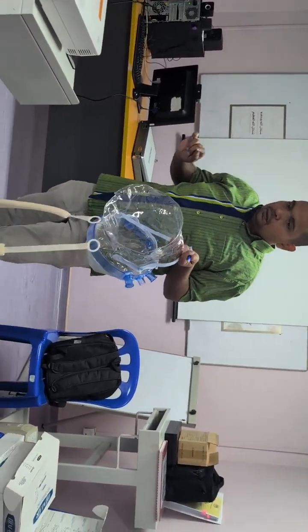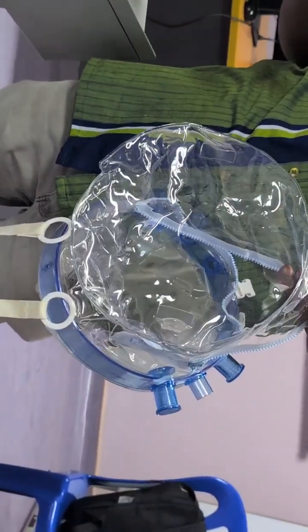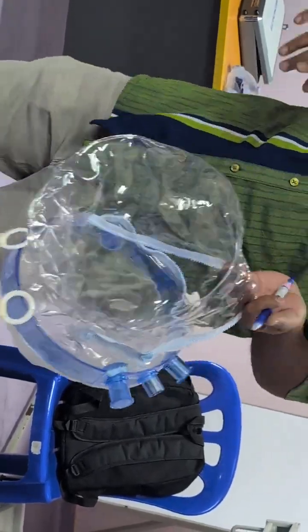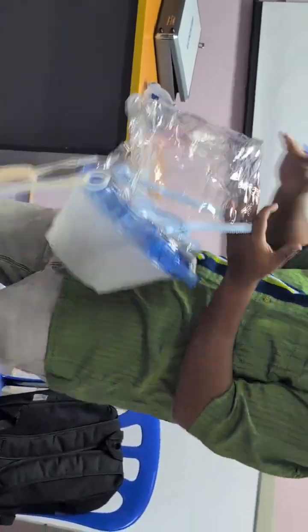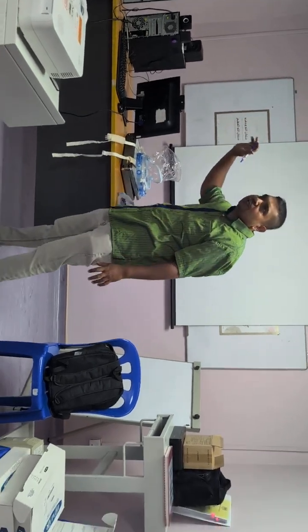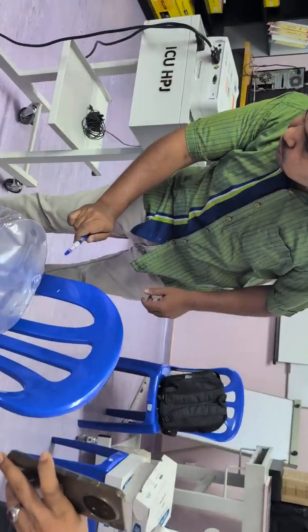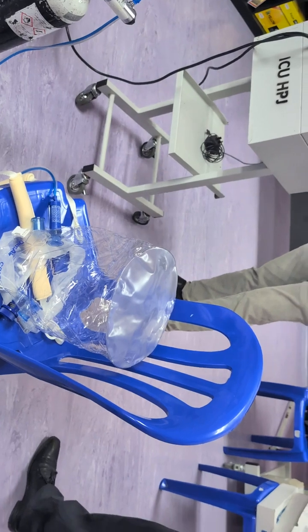Okay? What happens if the electricity goes off? We have a backup. Okay, what happens if the oxygen finishes? Okay, in a ventilator, I'm not worried. Okay, because that flow is going to be giving you the amount of noise, everybody is going to be awake. Alright? But what happens when you use this or you use any mask and the oxygen finishes?